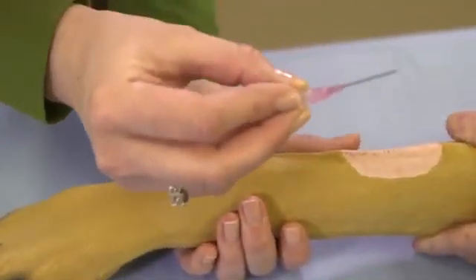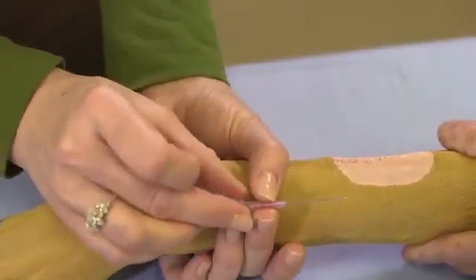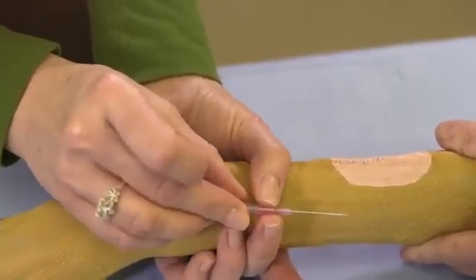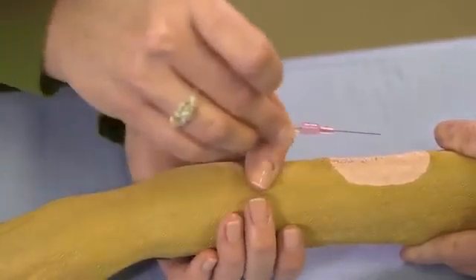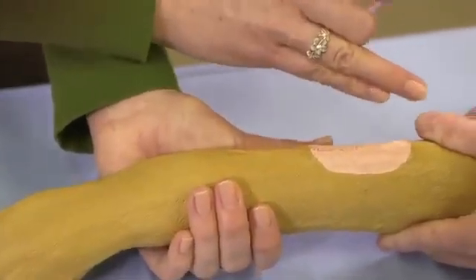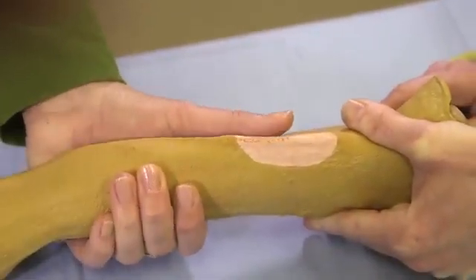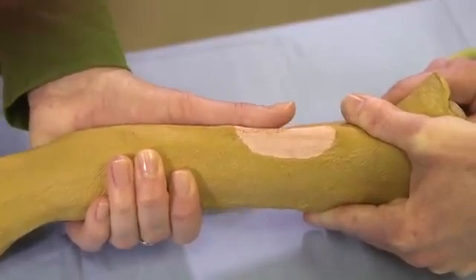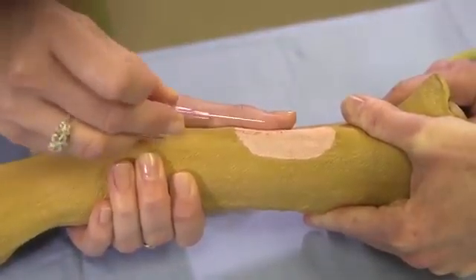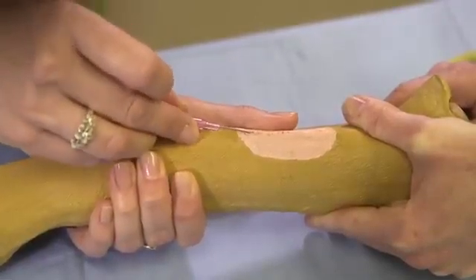So, bevel up. You grab your stylet firmly. Make sure your catheter is all the way back onto the stylet, not coming up a little bit, otherwise you can't get into the vein. Grab your leg. Your restrainer is squeezing and twisting that leg to make the vein pop up. Place your thumb next to the vein. Hang on to your stylet and poke into the vein.